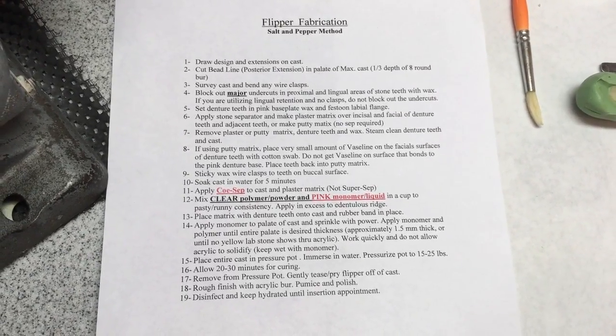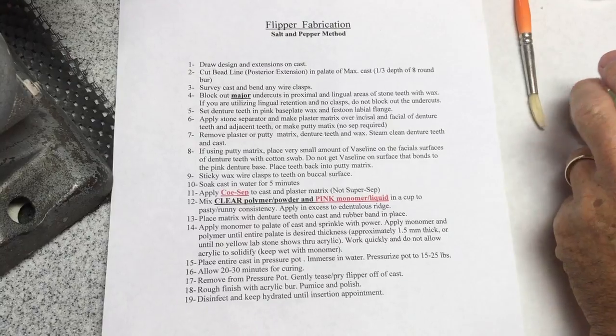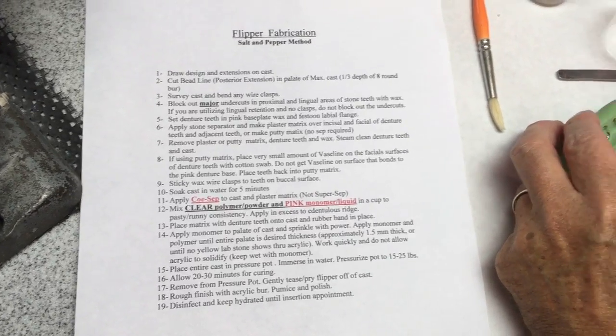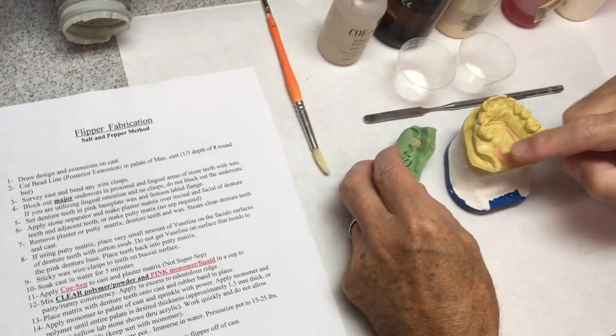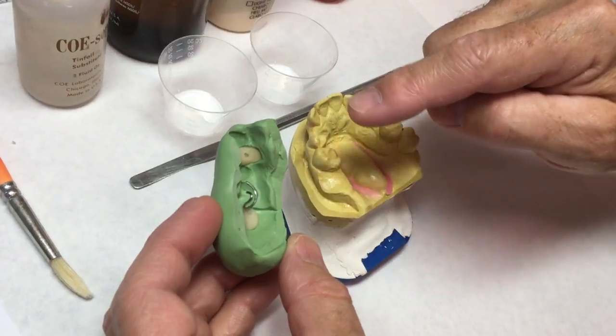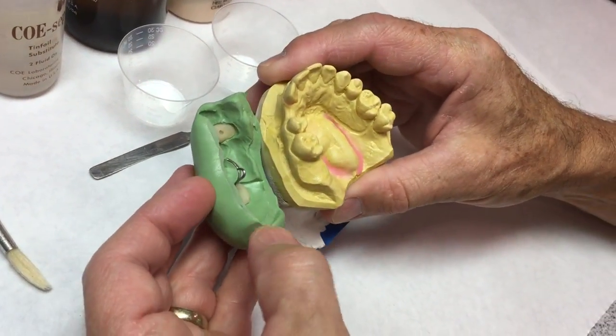Today we're going to salt and pepper a flipper. I've done the preliminary work — I've already set the teeth in wax, bent the wire, put a bead line in it, made the putty matrix of the teeth, cleaned out all the wax, and steamed off the teeth. So now we're just going to acrylic it back together.